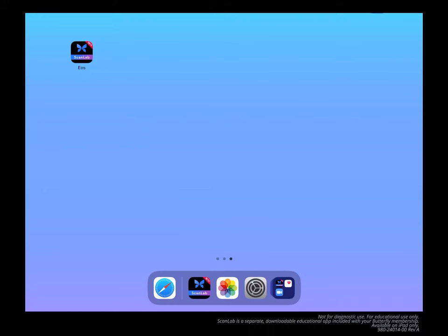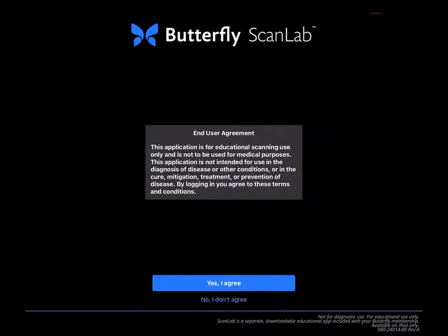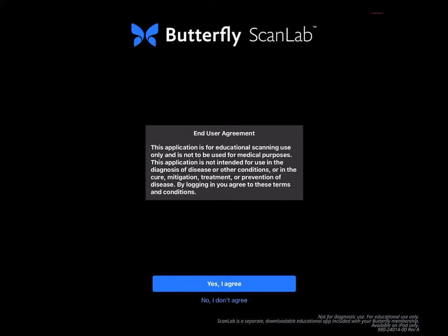After downloading the ScanLab app from the Apple App Store, open the app and log in using your Butterfly Cloud credentials. Read through the limits to use, ensuring that you're using the application for educational purposes. Confirm you're not using ScanLab for medical purposes by tapping Agree, and plug in your Butterfly device to move on to the next step.